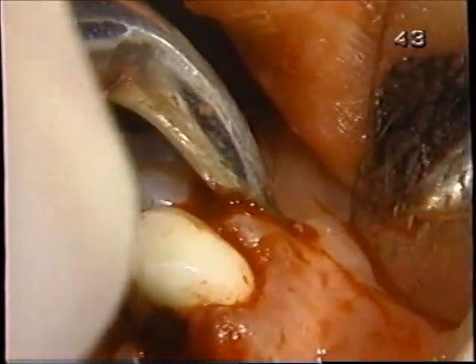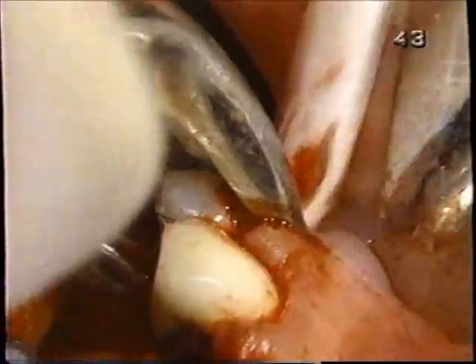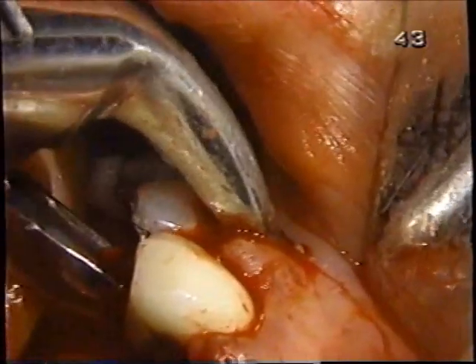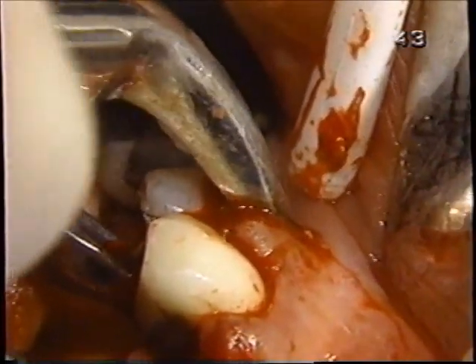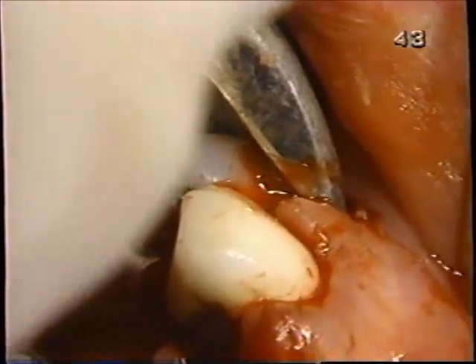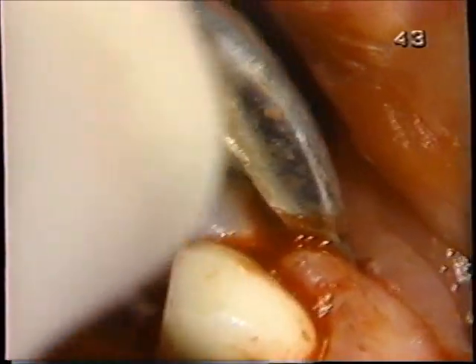With this bicuspid, we are using the 151S. We decided not to use the straight elevator at all, and that's because we felt it would dislodge the crown on number 22. So we're using this 151S for luxation with rotational movements and buccal lingual.